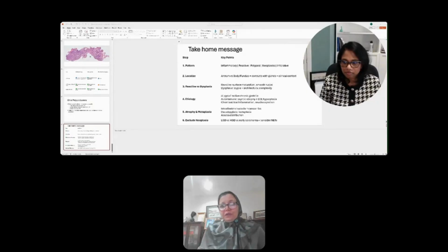Finally, I suppose with experience, you don't need to do immunostaining to identify Helicobacter pylori in most cases. But what would prompt you, or what would you advise someone handling gastric biopsies, to do immunohistochemistry even if you don't see the H. pylori?